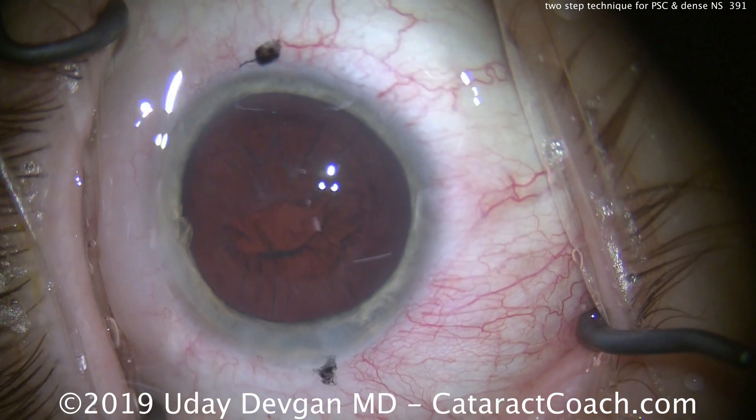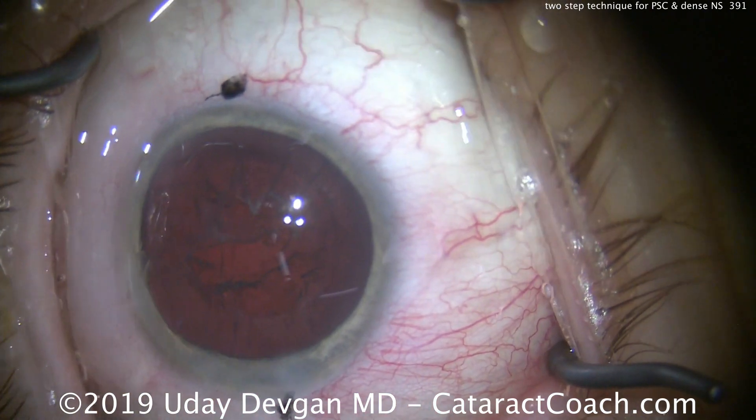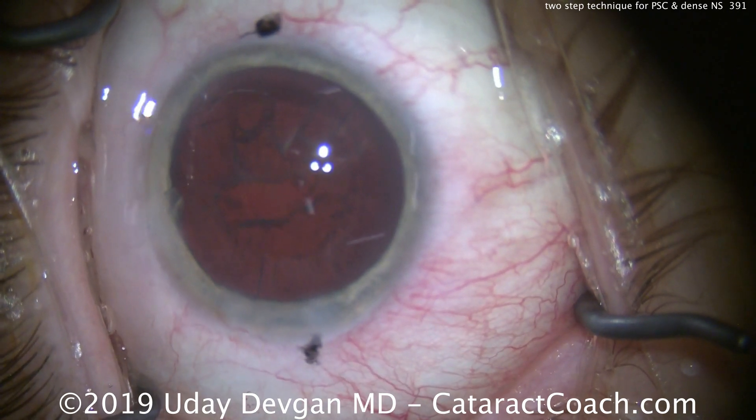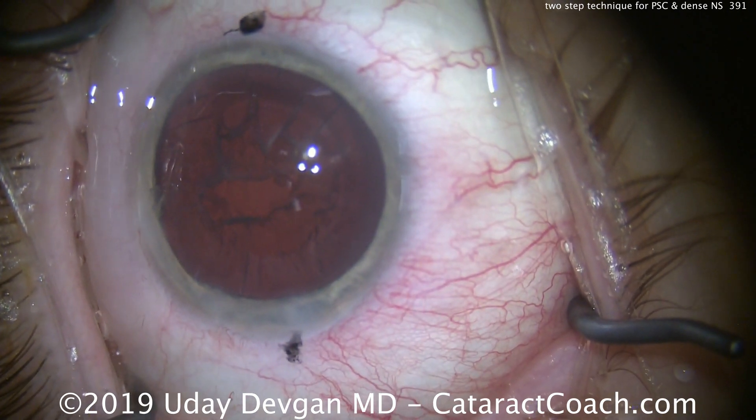Look centrally there — you can see the area where the plaque came off. It's totally bare in the middle. The granular plaque has been completely removed.